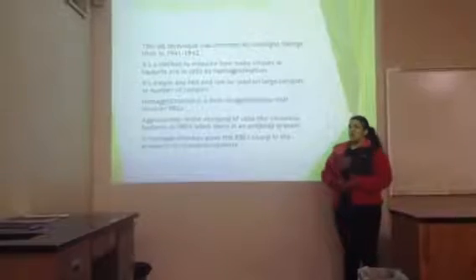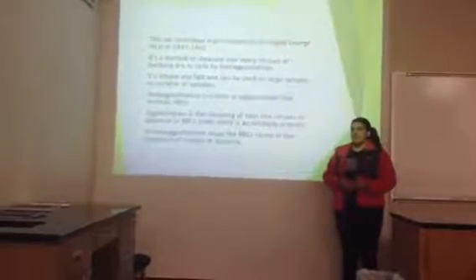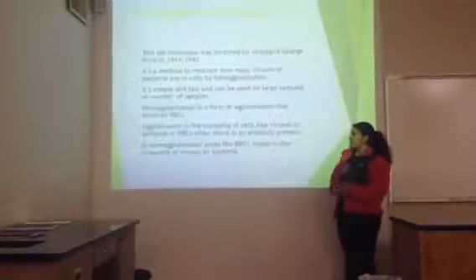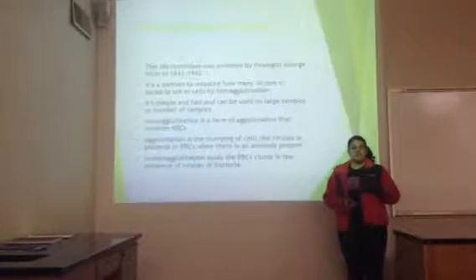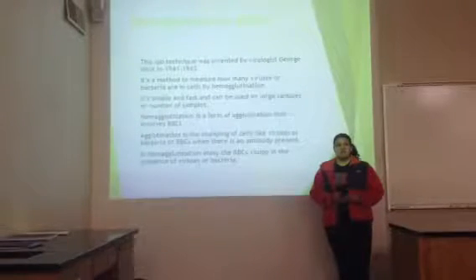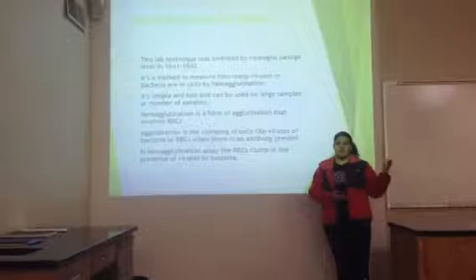It's a form of agglutination, which is the clumping of cells in the presence of an antibody. So in the case of hemagglutination assay, the viruses and bacteria are going to clump to the red blood cells.